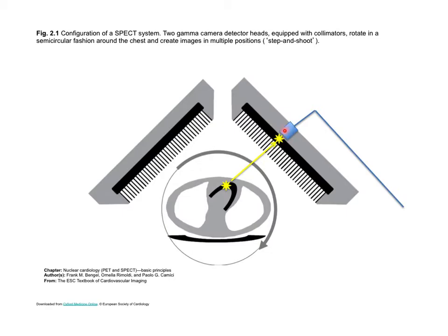We'll look at the mechanism, how this detector works. Ideally, this detector produces a projection of the radiation coming out of the patient perpendicular to this orientation. You want a projection of how much radiation you have in there.